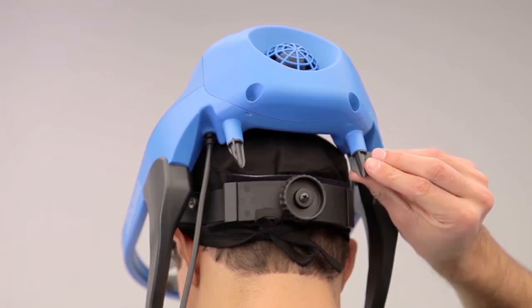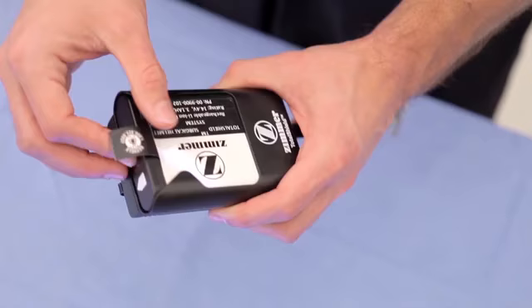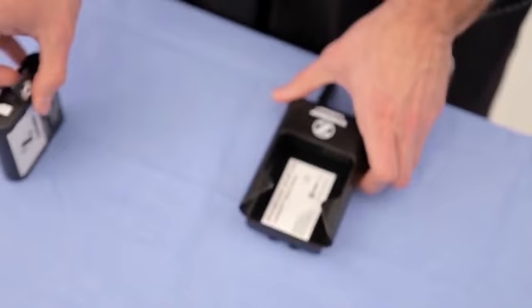Next, rotate the rear adjustable air outlets to direct the airflow as desired to the back of your neck. To turn off the helmet fan, remove the battery from the battery holster.